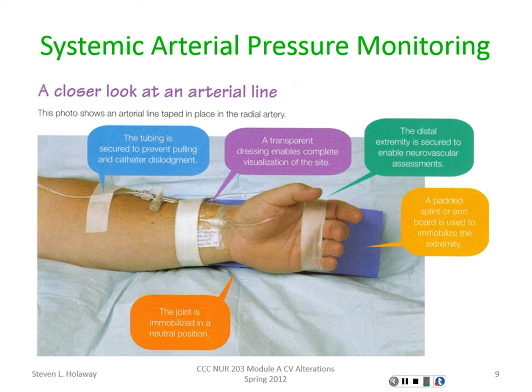When we do the hemodynamic, what am I trying to say? Next week in the afternoon, I'll actually have the lab set up, and you can come in groups, and I'll actually show you how to draw the blood from those areas and everything. But basically, there's certain steps you'll go through. You can see they put a board behind this one to kind of keep it steady, so it's there. There are connections here and connections back up going up to the transducer, and I'll show you in a minute.